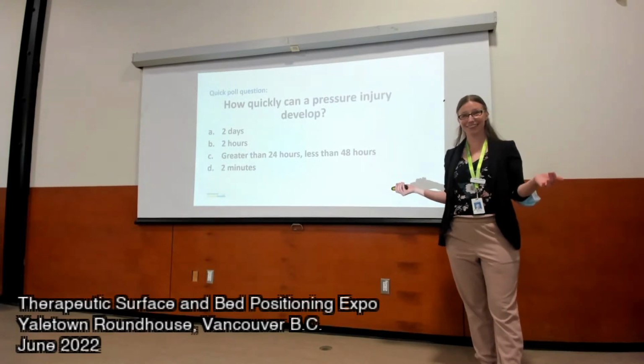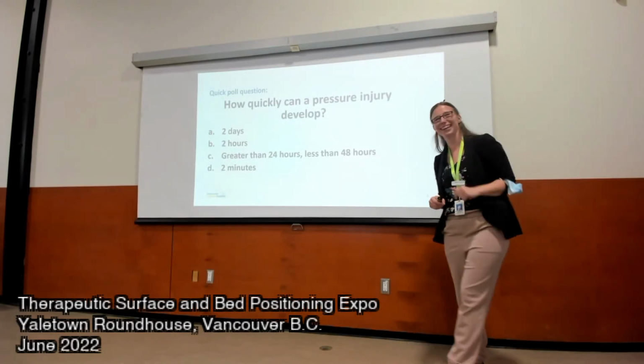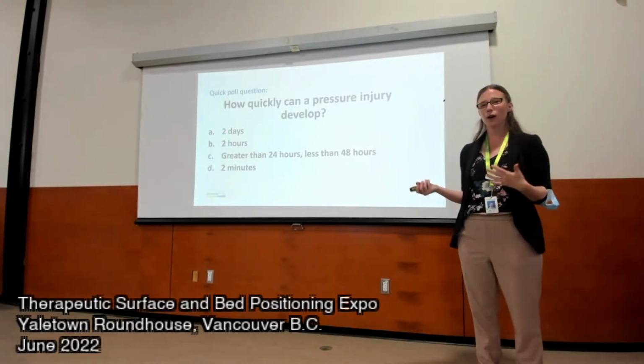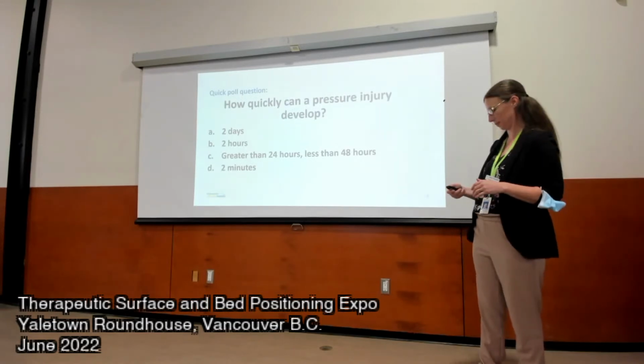Anybody? Brenda says 2. 2 what? Hours. Very good. There's a lot of twos on there. 2 hours, exactly. So that's why a lot of our repositioning schedules are based on the 2 hours.